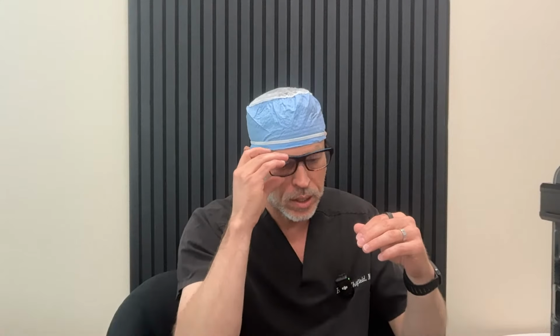So for us, every patient that has an implant placed, and in this case, we're talking about a breast implant, forms a little fibrous capsule, which is like a collagen sac around the implant. And normally this remains soft. If that just goes throughout time and remains soft, typically people don't complain of or have problems with pain or distortion or a change of position. And so they don't typically seek out any help for that.